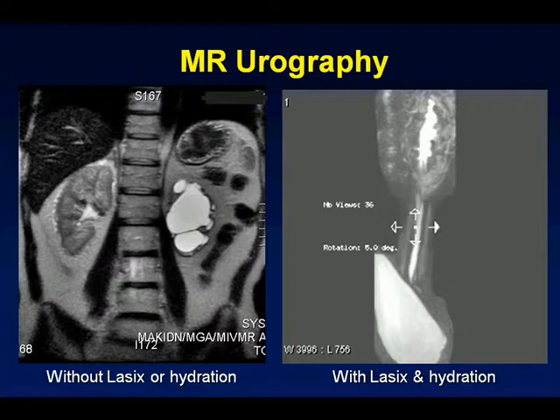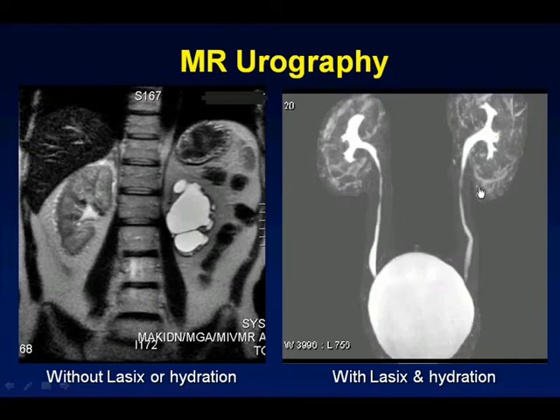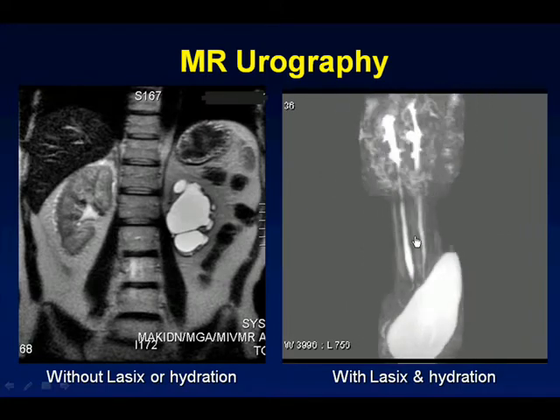So the case on your left here, basically, when the patient's obstructed, it's pretty easy to see the collecting system, but when the patient's unobstructed, it's really hard to see the calyces quite well, especially in a hematuria workup. So when you distend the system, you can definitely see that it's much easier to interpret the collecting system here.